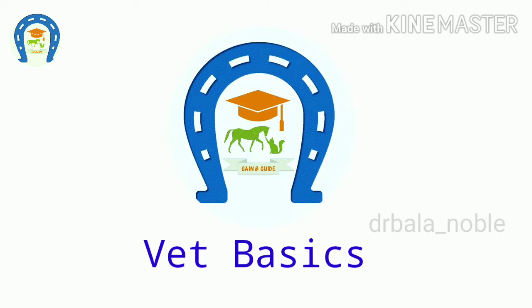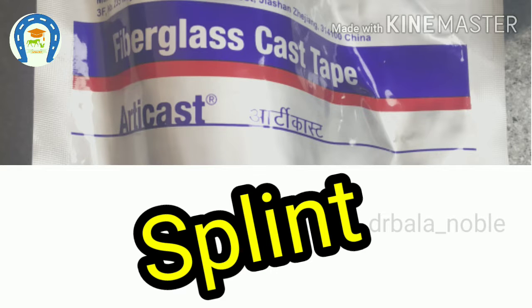Hello everyone, welcome to vet basics. Today we will see about application of splint with fiberglass material.